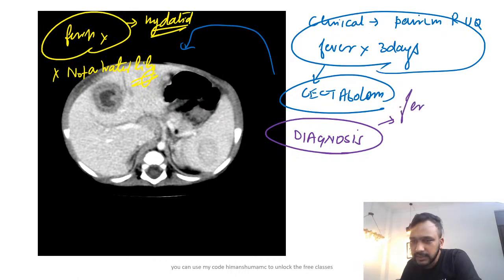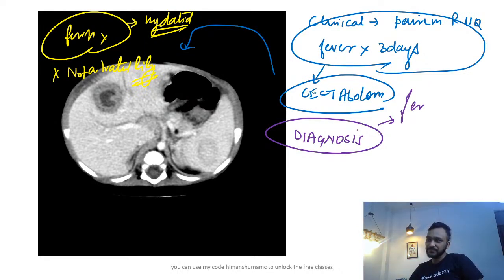Which is the pathology that you know within the liver that is going to present with fever, guys? Very simple question. Pathology that you are aware is going to present with fever.